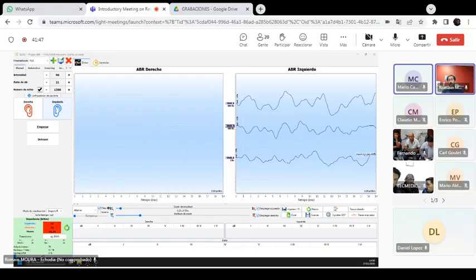So you will have all the frequency and the intensity range. But I don't remember if this device was sent with the bone conductor. I don't know. And if you don't have the bone conductor, you cannot check the intensity, but we can send a paper with the proof or whatever.